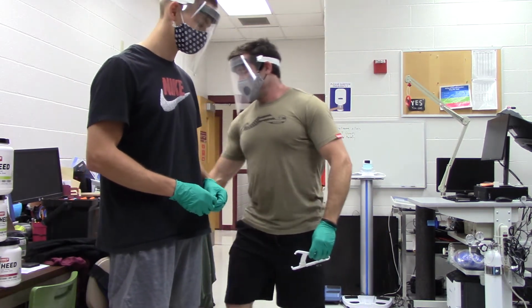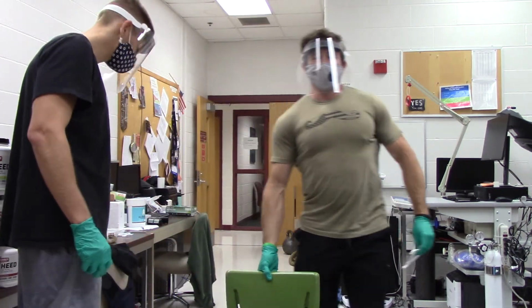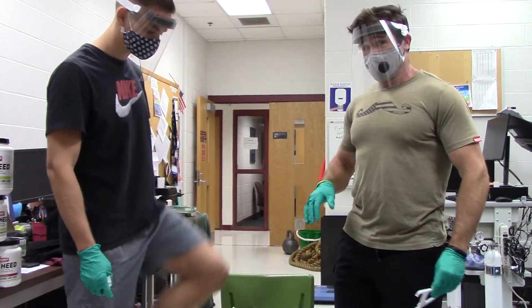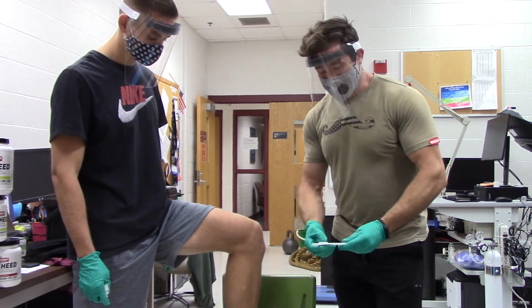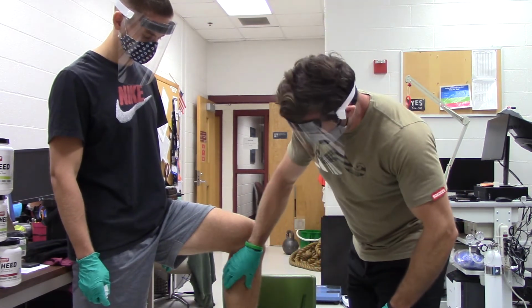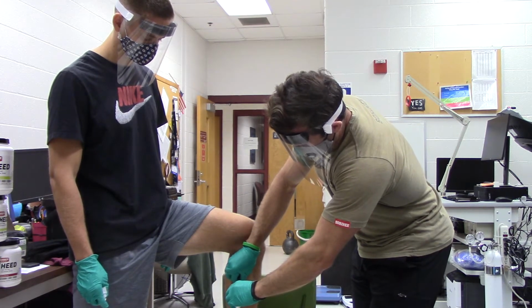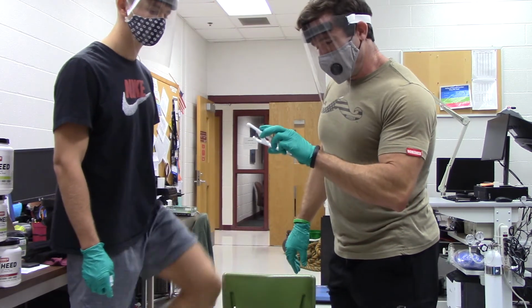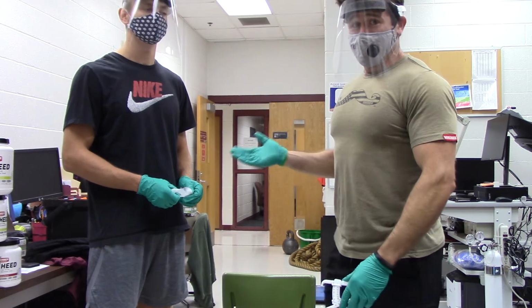Now the last but not least we're going to have him do is the calf measurement. And he's going to typically do this with his right leg, but we're going to have him put his left leg up here just to be easier to see. We're going to take the biggest girth, and unlike me, he actually has calves. So we're going to take the biggest part of his calf, which is right here, grabbing on the inside. We're going to take that skin fold caliper and close it till it measures, relax, and a grand total of about 5 millimeters, because Yehor is a skinny guy.